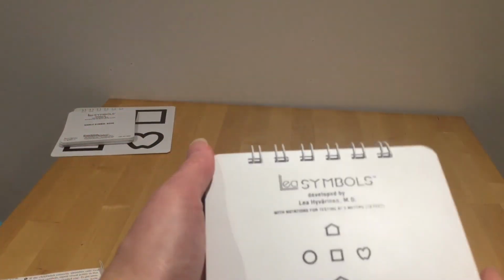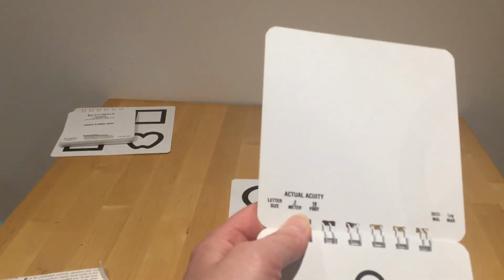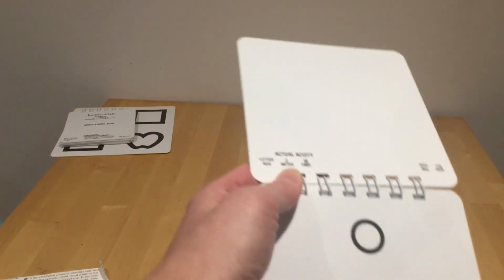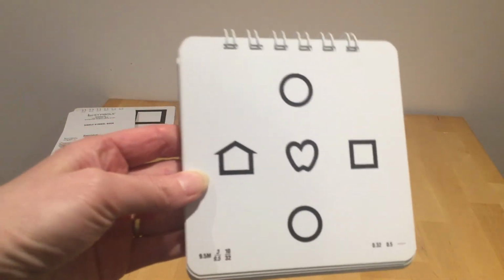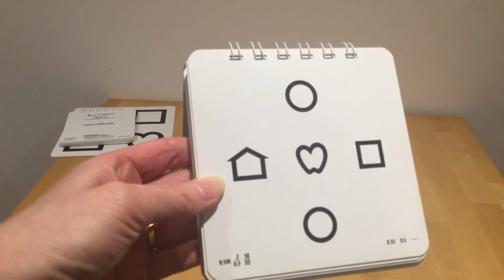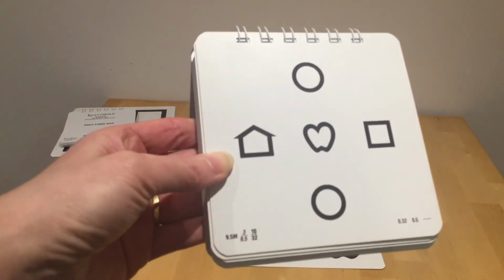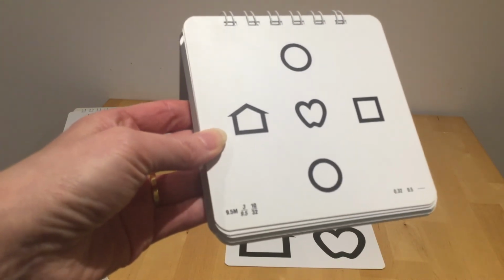And you'll notice when I turn it over, the same thing on the inside front cover, 3 meters. And the array of shapes on the page is very different from the single symbol book. And we're starting off here at 3 over 9.5.